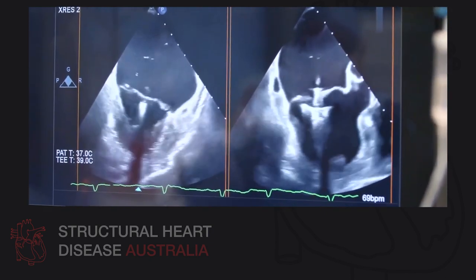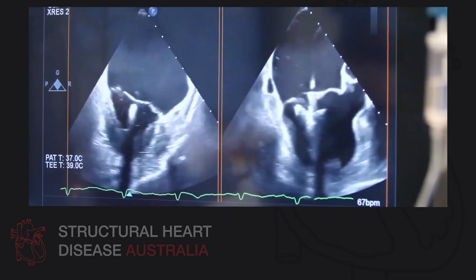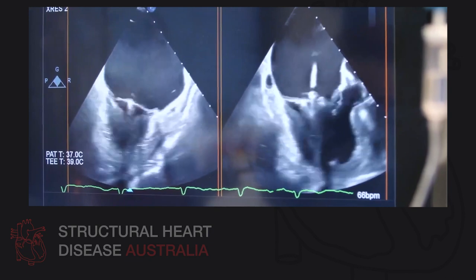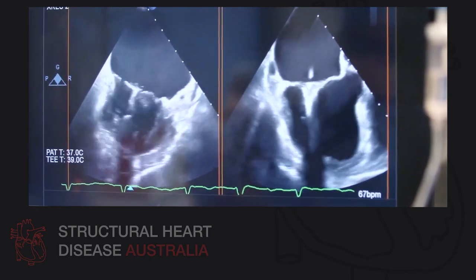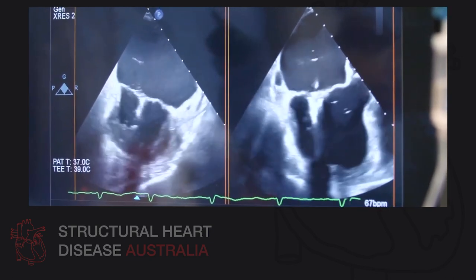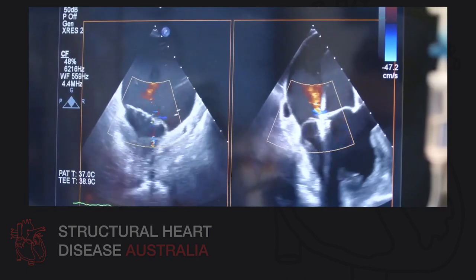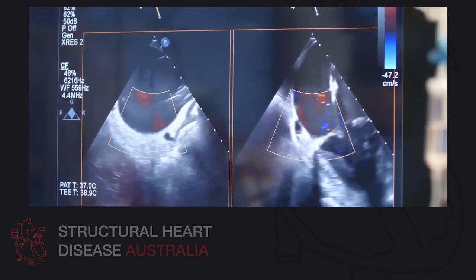Okay, ready? Record now. Okay, lower grippers, please, Michael. So we're going to close the arms a little bit. So now you can see the closing of the mitral clip arms. And you can see there live on the left atrial pressure trace, that orange pressure trace, that the V wave is coming down. So there's a relative reduction in the V wave with the capture grasp.